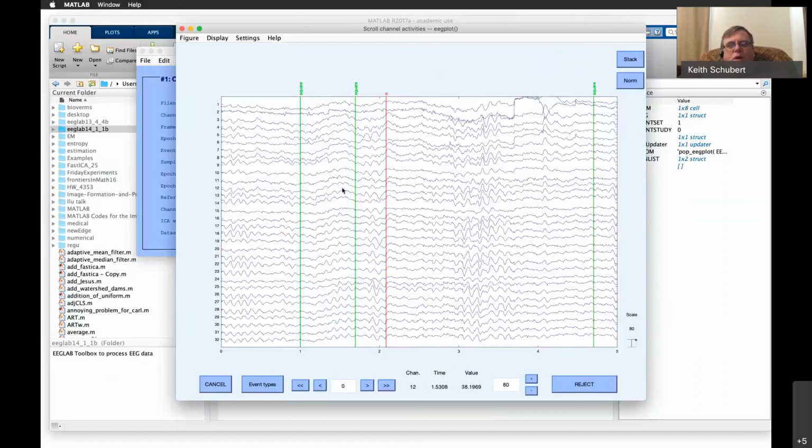If you ever get a data set and it looks completely blank, like you load it up and maybe there are event markers, but there might be one or two traces and then a whole bunch of nothing, that often happens if there's a baseline, a DC offset.